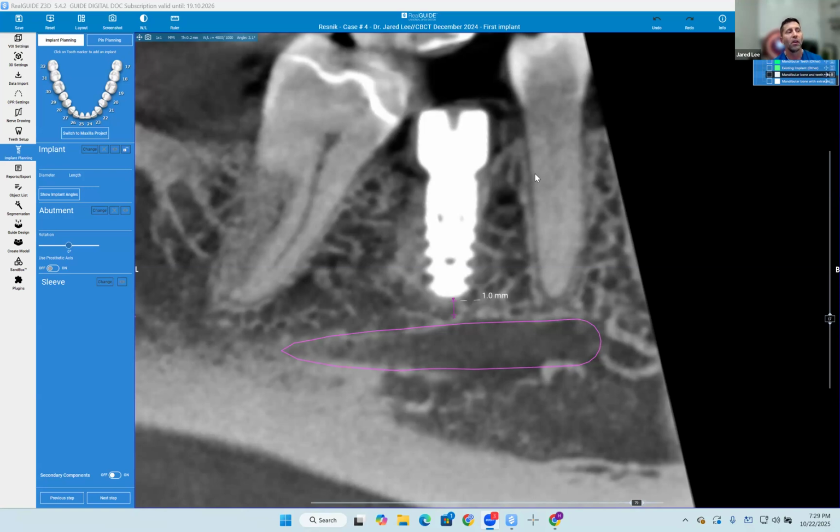And then at that point, the bone integrated, everything was good, no pain, no numbness, everything returned to normal. Now, a follow up on this, since I submitted all these: we did go back in, we planned it, we made sure there was 3 millimeters of space between the nerve and the implant. We replaced it. Everything was perfect. We went 1 week, no symptoms, no nothing, no pain.